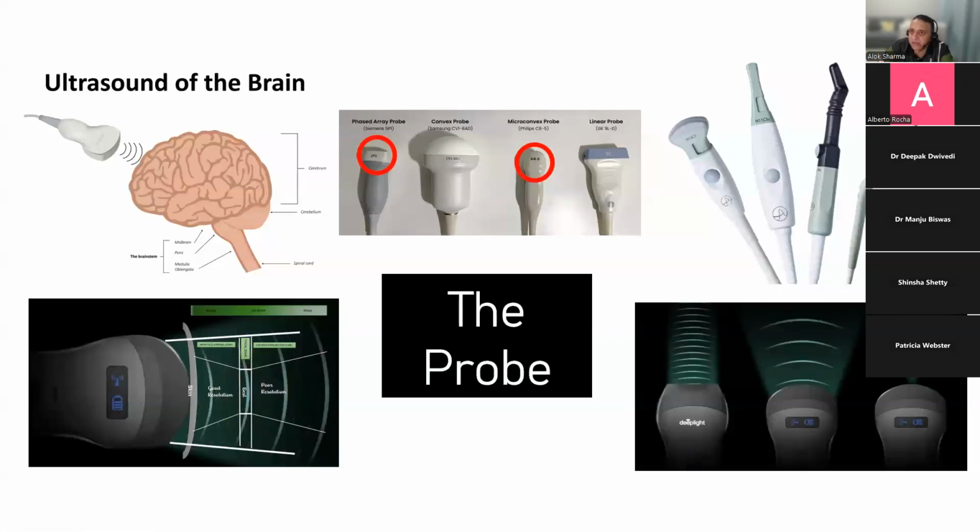So, what is time gain compensation? It's a beautiful function. What time gain compensation does is, naturally, from our perspective, we've got this region over here. Gain is brighter in this region, gain is not so bright. And some of the objects that you see are actually very minuscule because it looks very dark in this area. So, what we can do is we can alter the brightness or the signal intensity of the returning waves in this particular area and make them stronger by using time gain compensation.